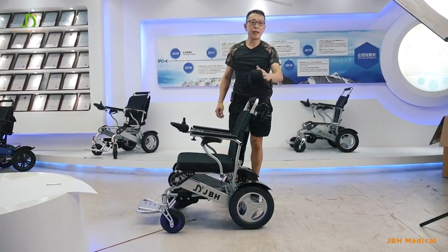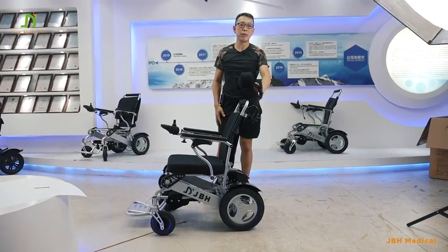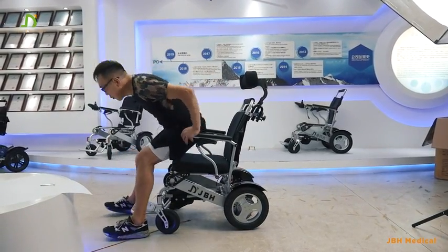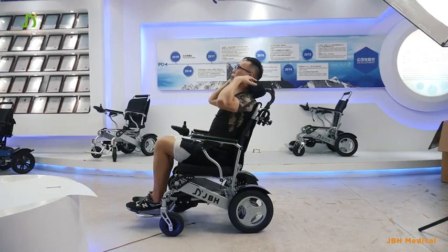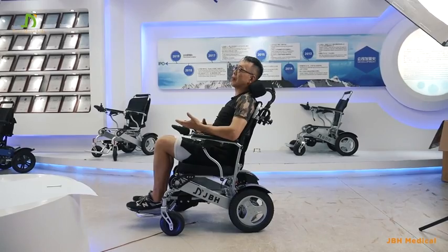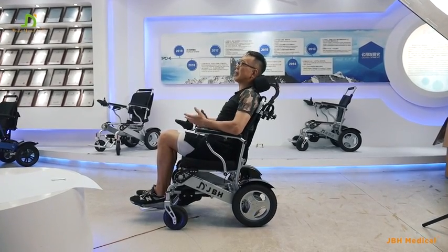This is the back neck rest for our DO9 wheelchair, and it's also suitable for other JVH wheelchair models. When you sit on it, you will feel the neck rest is really nice and attaching on the neck. It will bring good comfort for users who are sitting on the wheelchair for a long time, and for any user who has a neck problem, it will help release the pain.